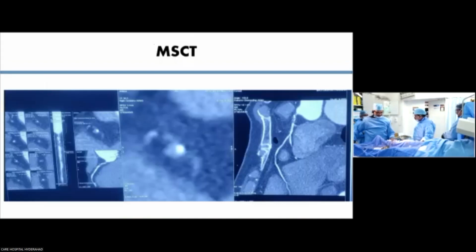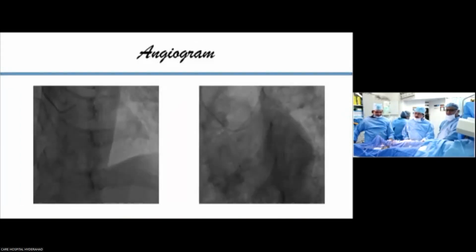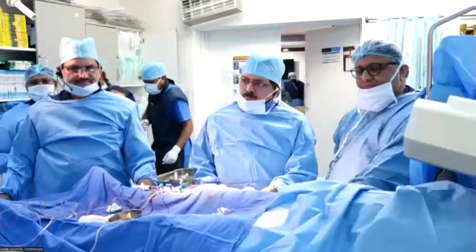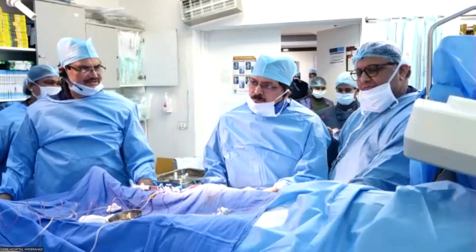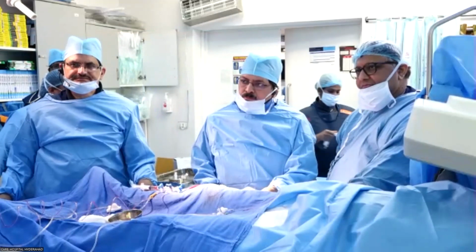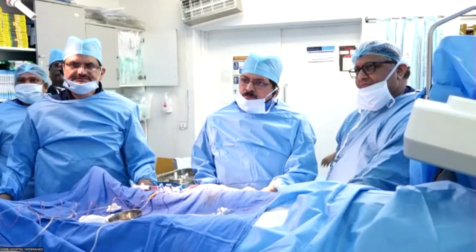So, Dr. Tiwari, I'm going to just pause with you for a moment. Maybe we'll kick it to the panel, Dr. Tiwari. So you've got a 55-year-old guy, effort angina, RCA CTO, looked like a proximal cap at the level of a small side branch, and you've got some retrograde collateralization into a decent-sized PDA, and then some collateralization into an RV marginal branch that's epicardial. What's your first primary approach? Do you feel like you want any more information? You also mentioned some hemodynamic support for this patient.